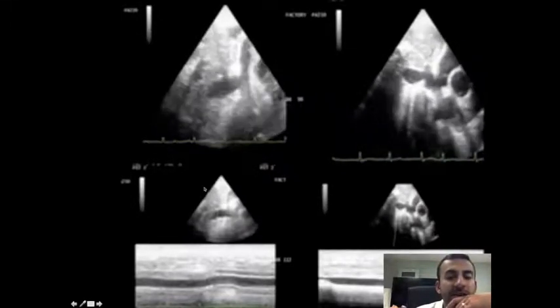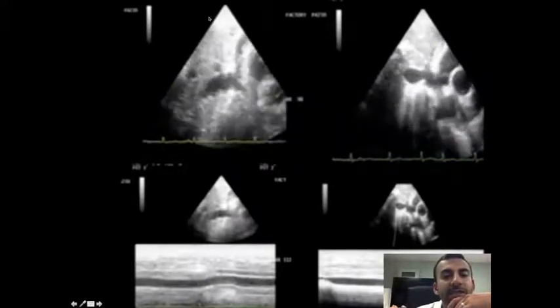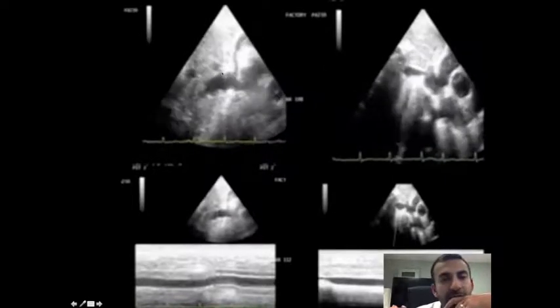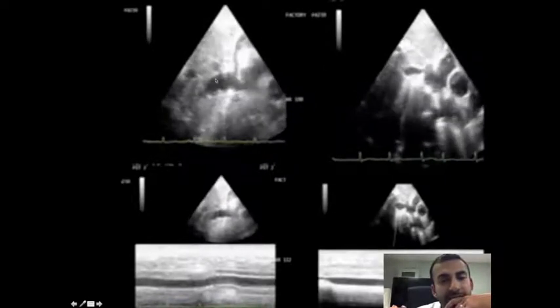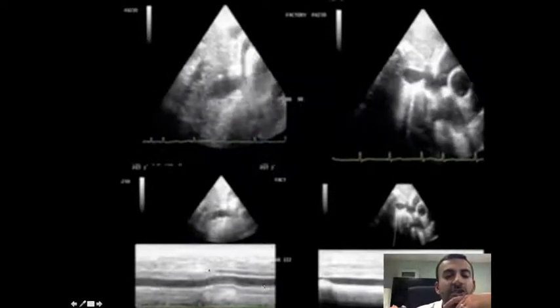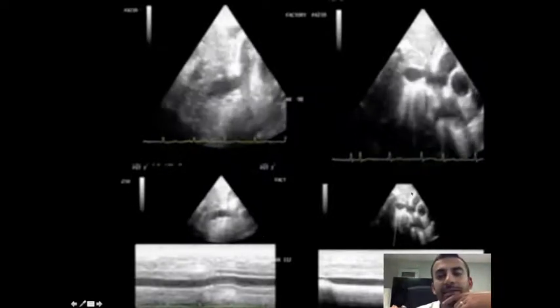on the respiratory cycle. And if we visualize this in M mode, so again, remember M mode is that dagger of ultrasound over time, placing it distal to this inlet of the hepatic vein, or approximately in this area, placing that over time and allowing us to see the change, you can notice that the diameter does not change very much. Well, let's compare that to the image here on the other side.